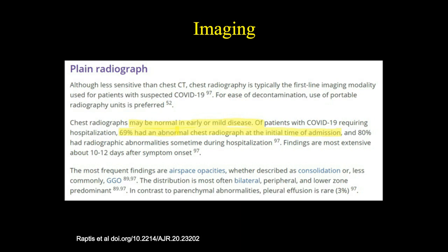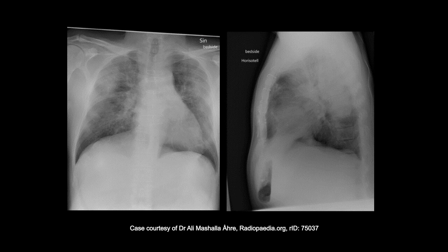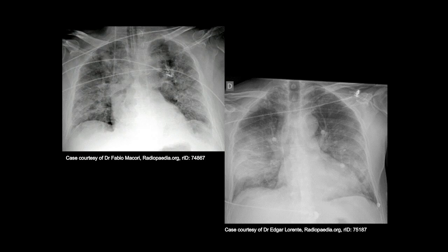Here you see a relatively mild case. I don't believe you can see my mouse on the screen, but if you look at the chest X-ray, the PA view, you'll notice that there are these very poorly defined patchy opacities in the peripheral zones of the lungs on both sides, or the lung fields on both sides. Here are more severe cases. Clearly you can see the findings are bilateral. They're peripheral. You're starting to see some of the septal lines within the lung, just a more severe manifestation of COVID-19 lung on chest X-rays.